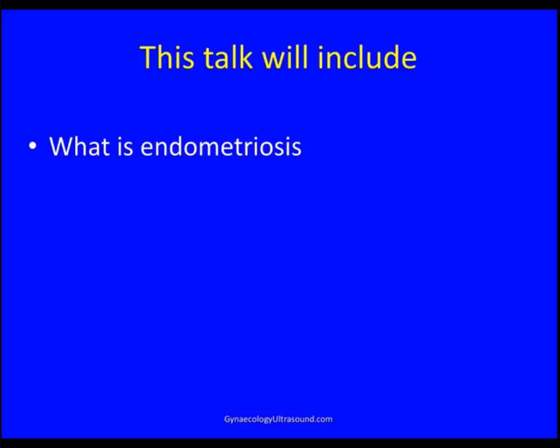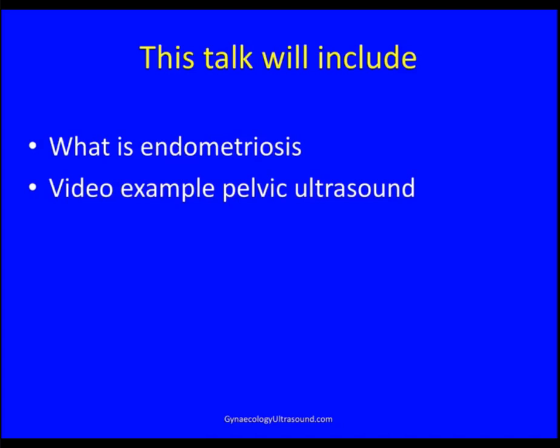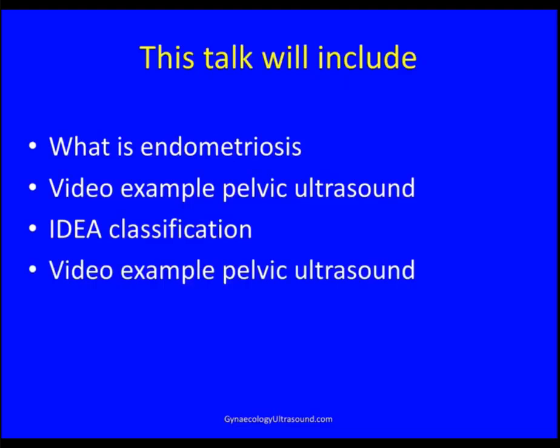We will talk about what is endometriosis, do a little video example of a pelvic ultrasound, talk about the IDEA classification, go back to that video example at the end, and then conclude.